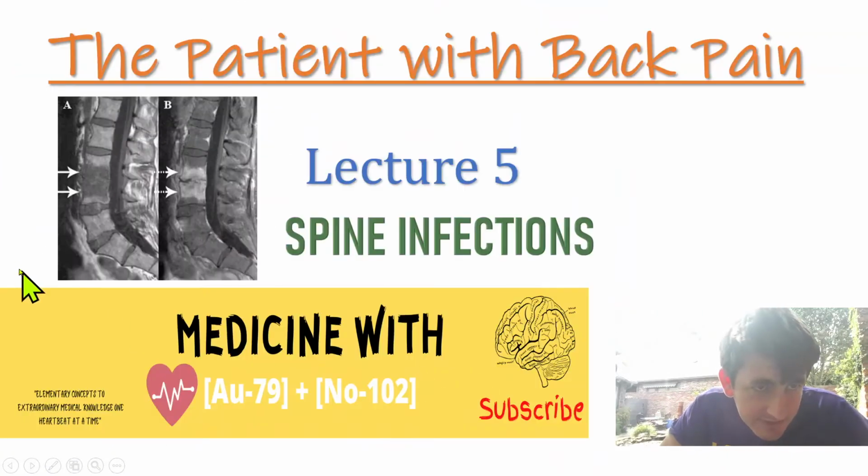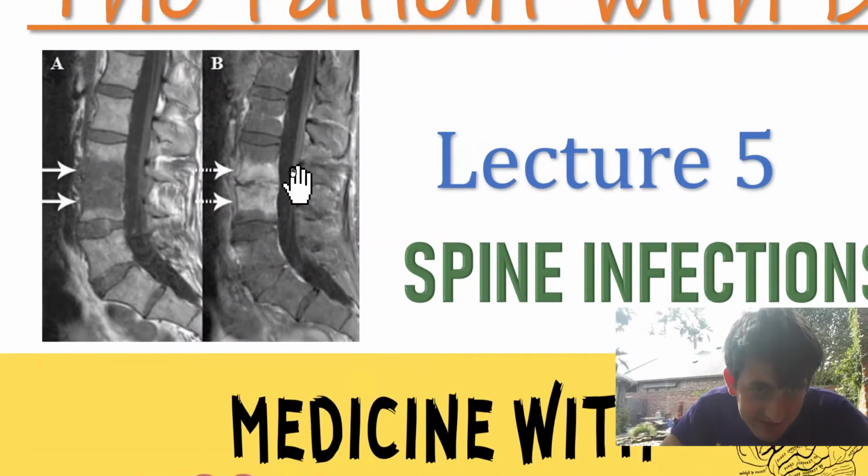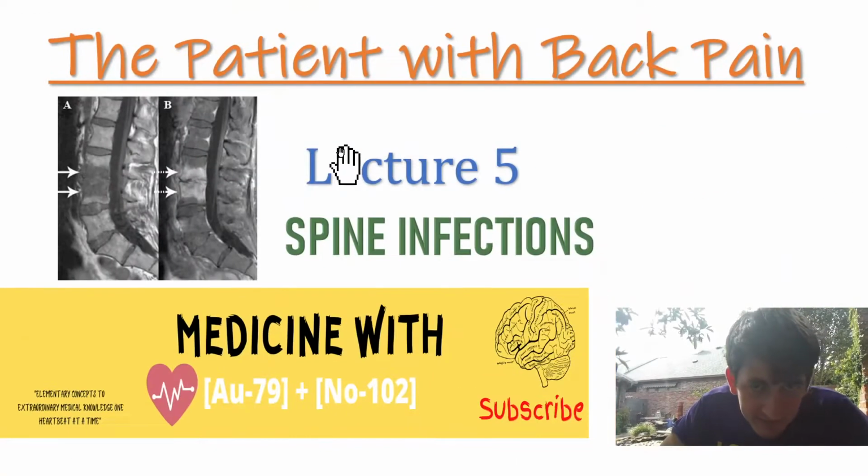And yeah, this is an MRI which we will discuss. That is actually one of these infections of the spine, vertebral bodies. You can see it has signal abnormality.